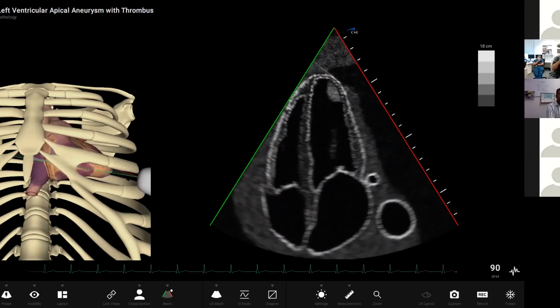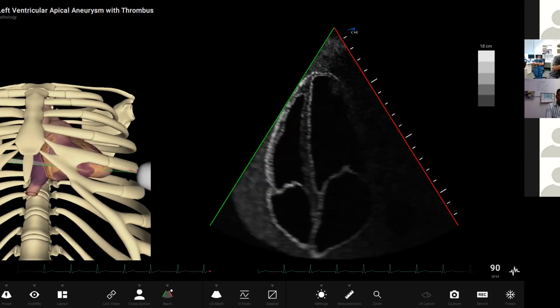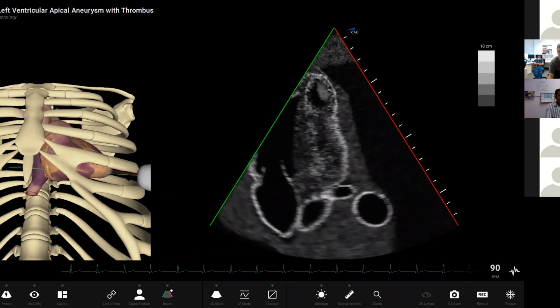So it's about knowing where to push. Sometimes even if you can't get decent images, it could just be a simple thing of the 2D image that you got, and making sure you're pulling down off that rib space and snuggling into that intercostal space.